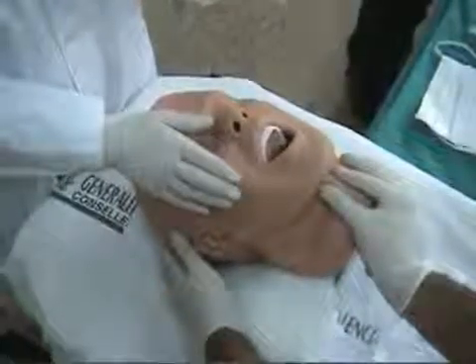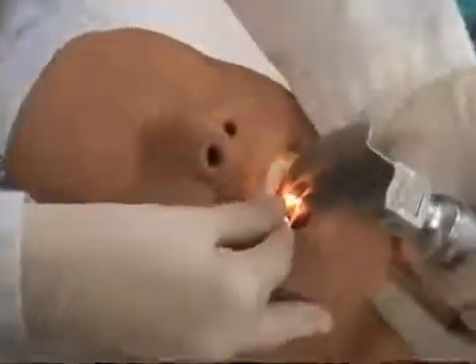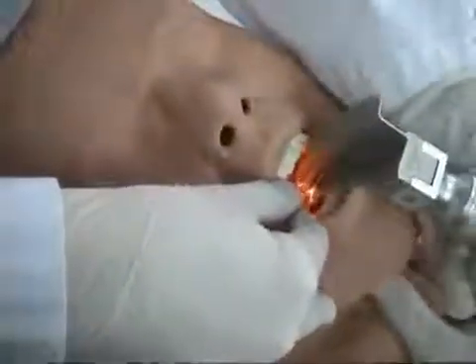Hold the laryngoscope with your left hand, blade down. Open the patient's mouth with your right hand and gently insert the laryngoscope blade into the right side of the patient's mouth and gradually move the tongue to the left to expose the epiglottis. Advance the laryngoscope blade to visualize the epiglottis. Put the tip of the laryngoscope blade into the vallecula. When the tip of the blade is correctly positioned, lift the laryngoscope blade upwards and forwards to visualize the vocal cords.